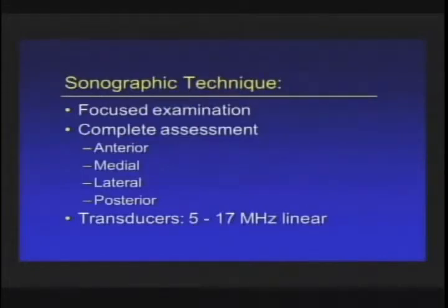At our institution, we prefer a more comprehensive evaluation. Every knee patient who comes in for an ultrasound is imaged the same way, anterior, medial, lateral, to posterior, so that as a radiologist, I know the imaging sequence that the technologist will save for me, and when I go in to scan, I would do the same thing. What's nice about that is my technique, I get to practice that.